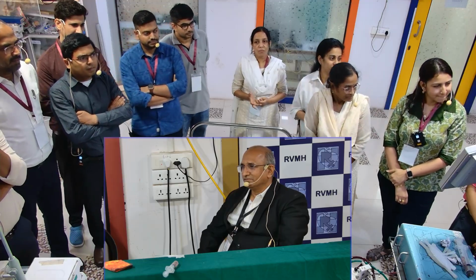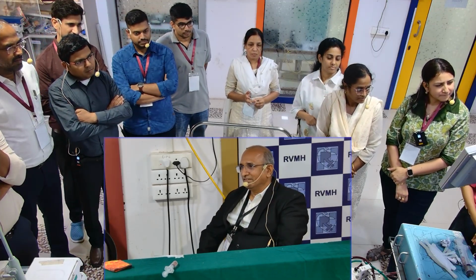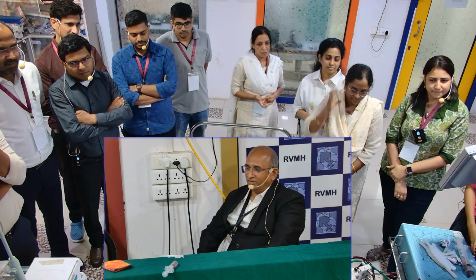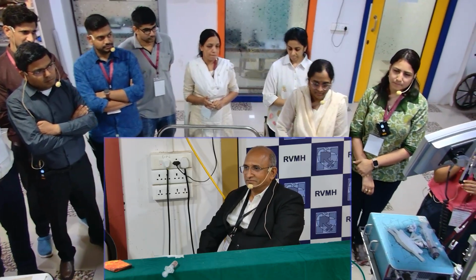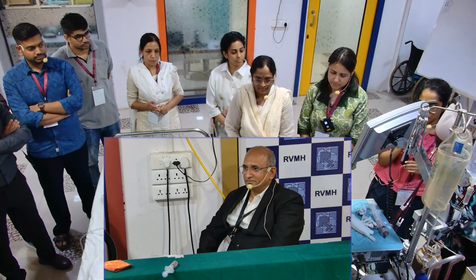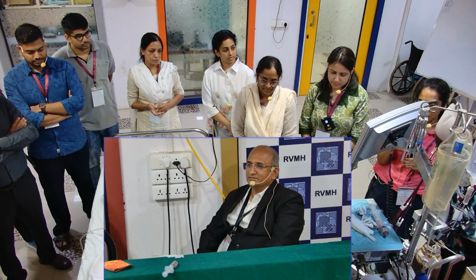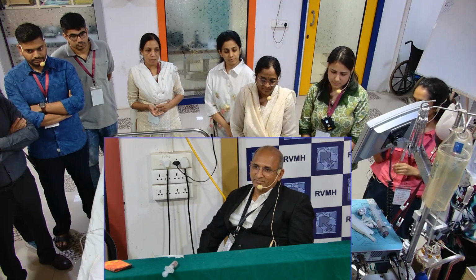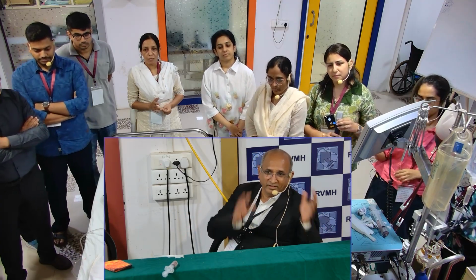Sir, the first thing, when there's hypoxia, the tubing color should be looked at. First look at the tubing color when there is hypoxia. We have to go system-wise. First divide whether it's a patient factor or machine factor, and once we feel it's the machine, go stepwise in each level. So the first difference is whether the problem is related to the machine or the patient, and then focus on that.